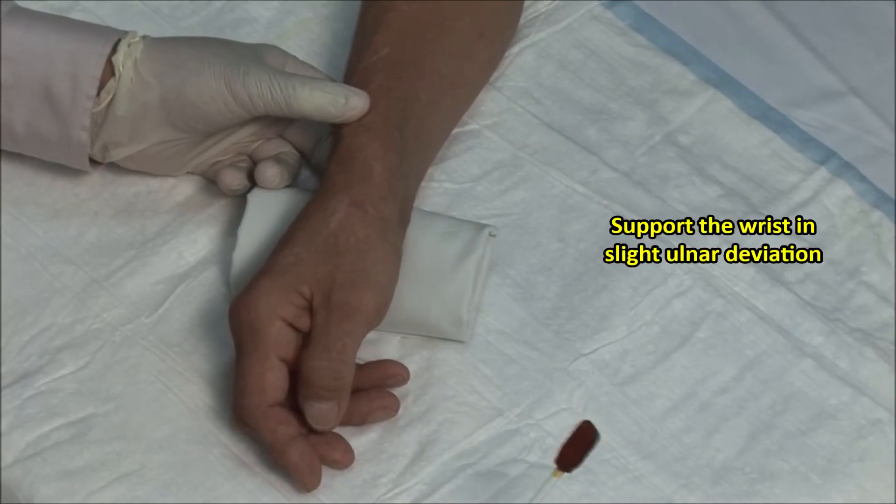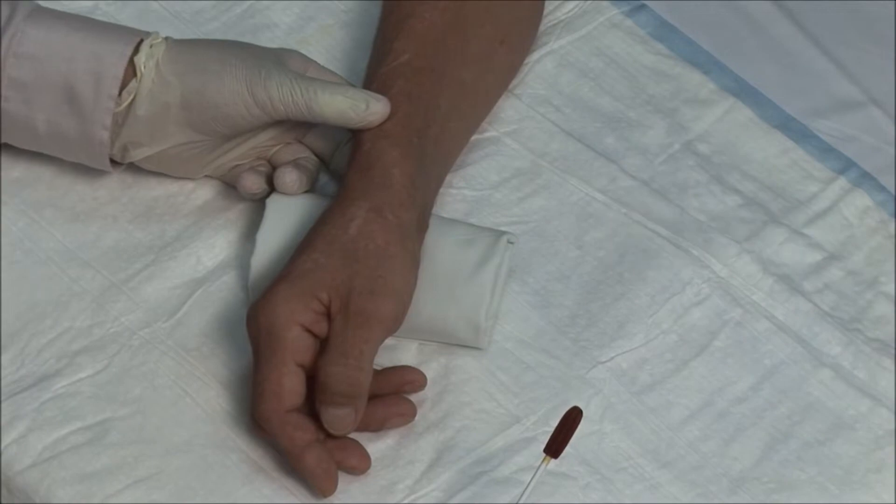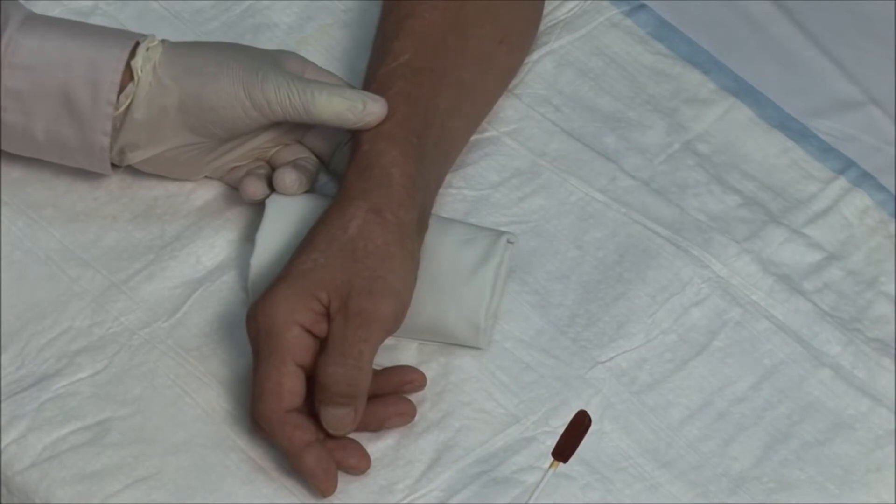For this injection, the wrist is supported in slight ulnar deviation. These injections should always be done using sterile precautions.